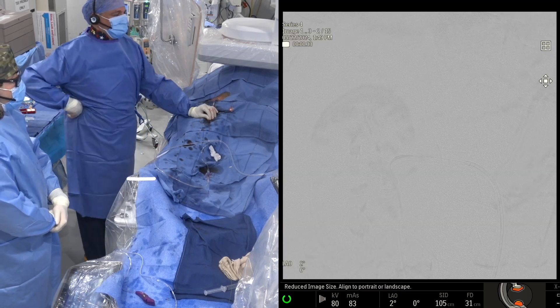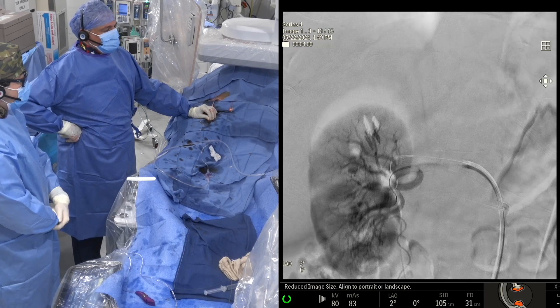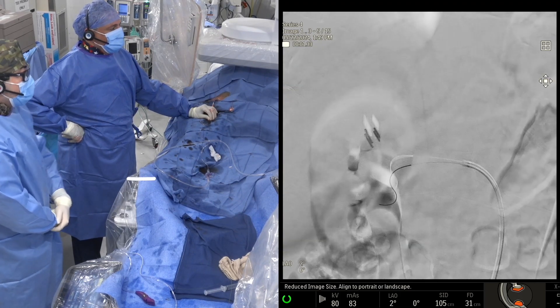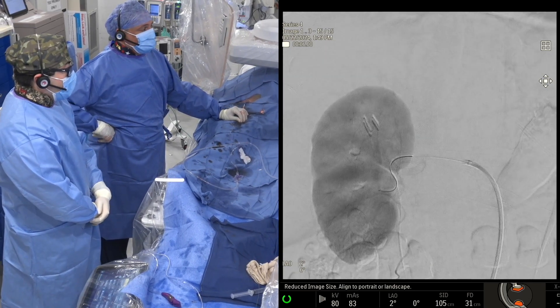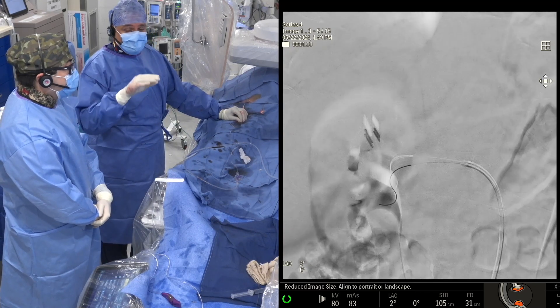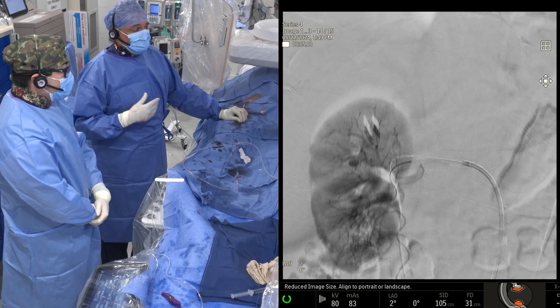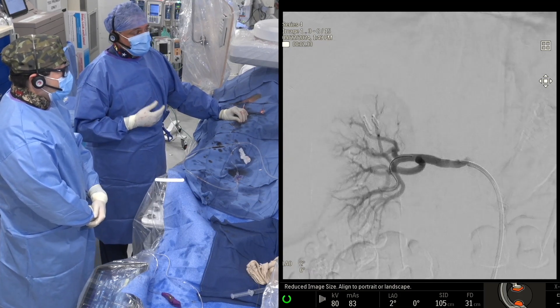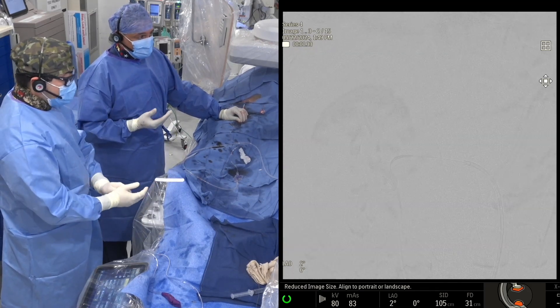This is the first picture of the kidney. Important in this picture is to rule out any significant stenosis, which there is not. We also want to make sure the entire kidney is visualized — making sure obviously there are no parts of the kidney that are cut off, because if so, you may have an accessory renal artery. This is also very useful because you can size the kidney without needing intravascular ultrasound.